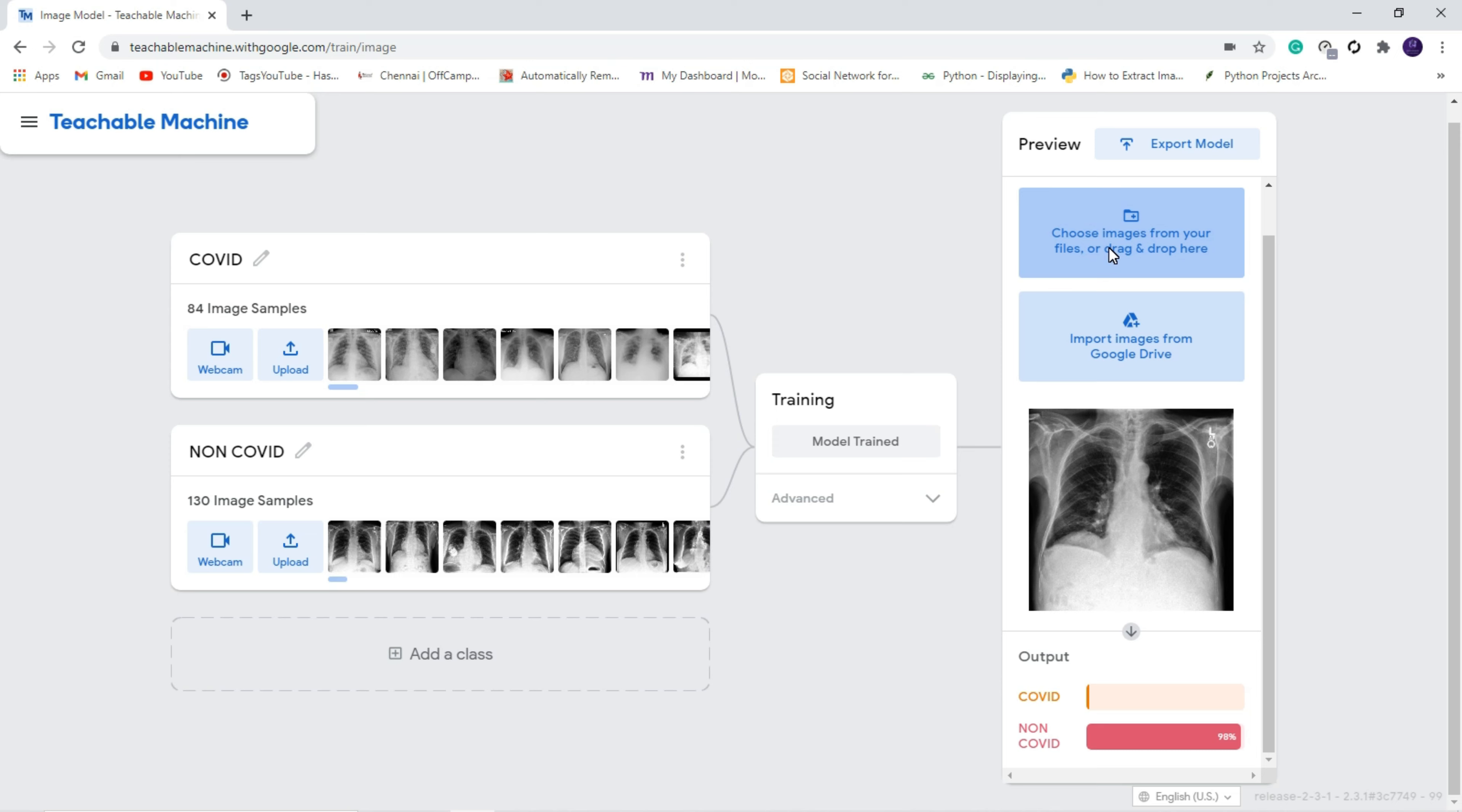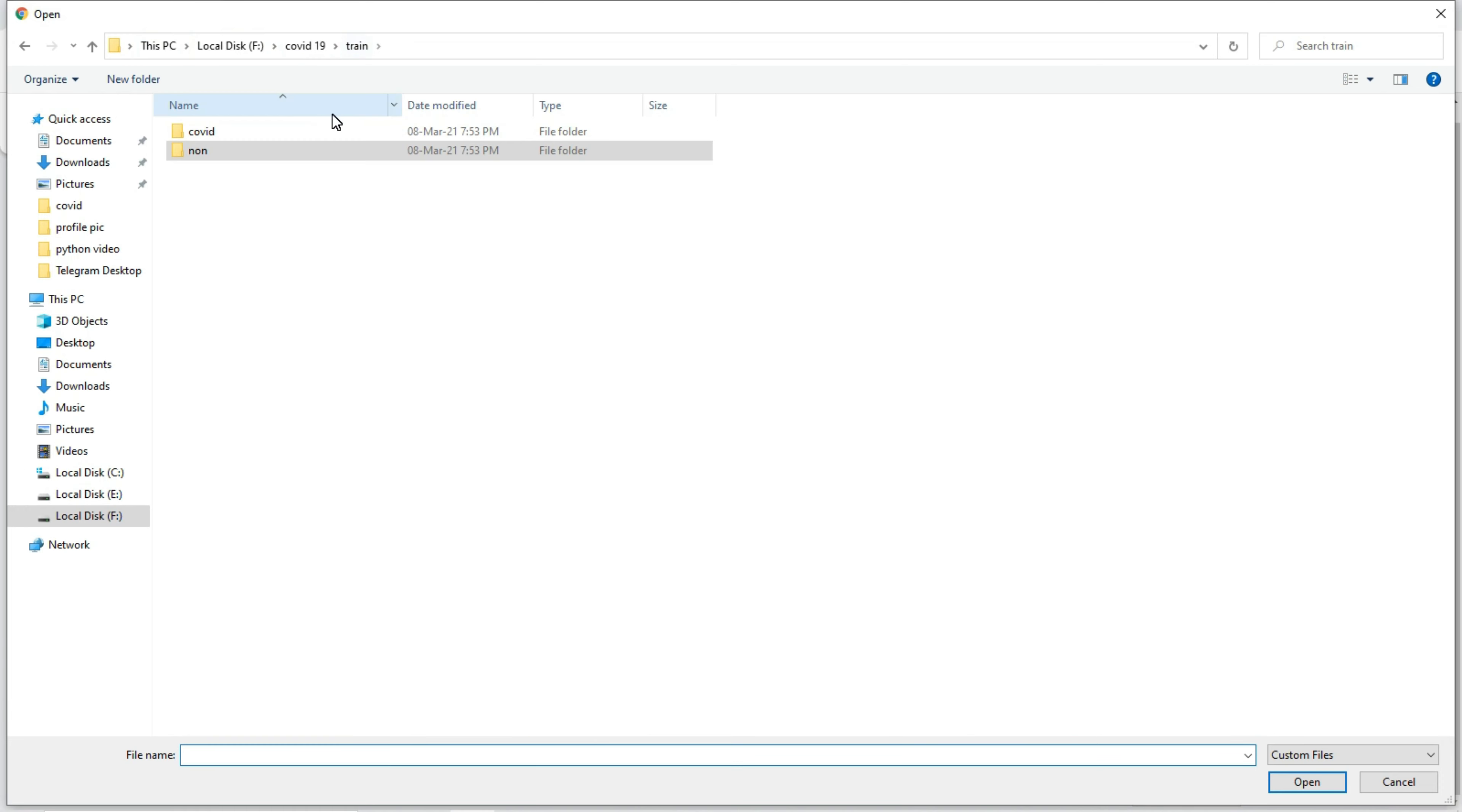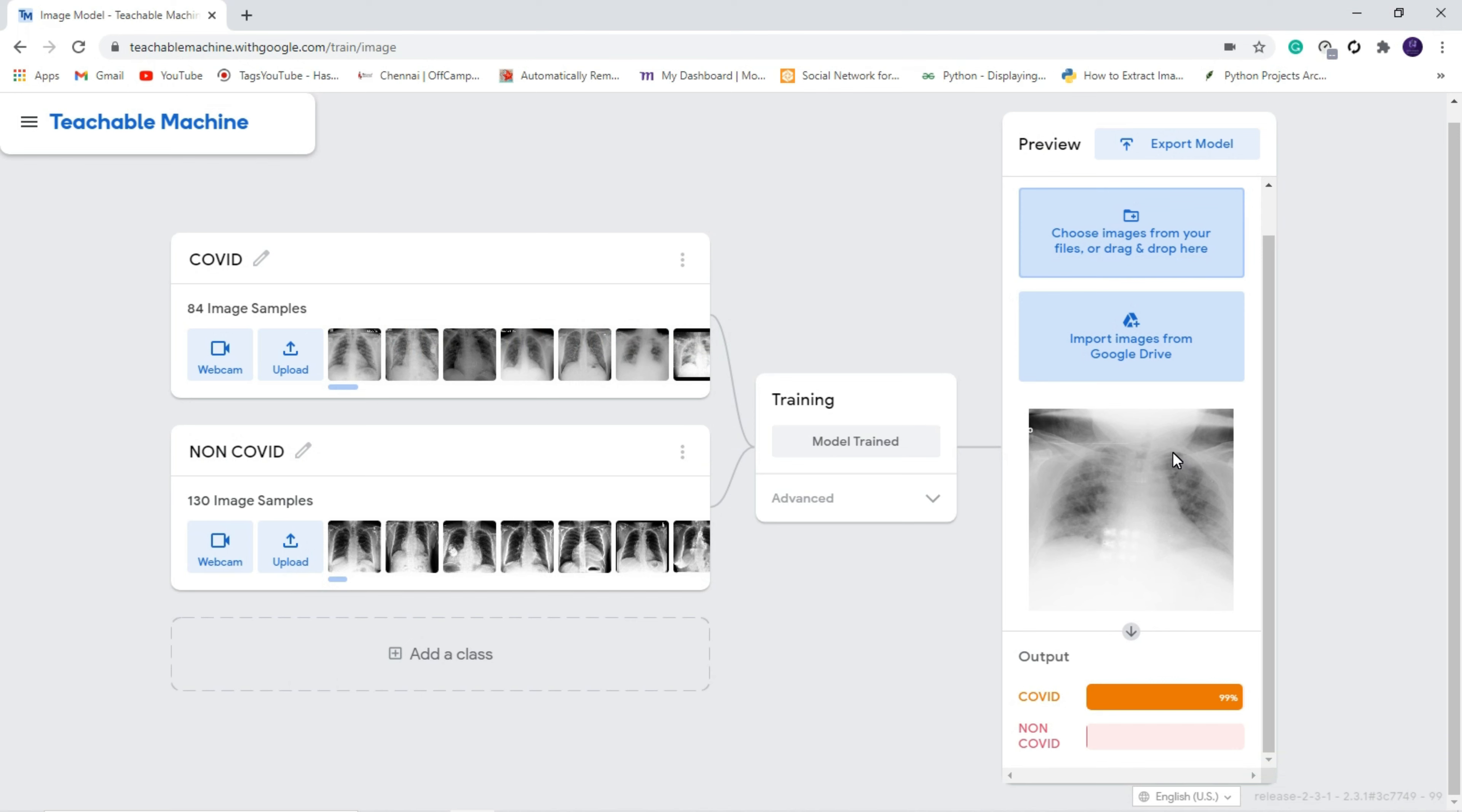Now let us check with the COVID images. Yeah, you can see it is showing 99 percent COVID and 1 percent not COVID. This is an X-ray image of COVID patient. This is how it accurately detects the COVID and non-COVID images from the X-ray.